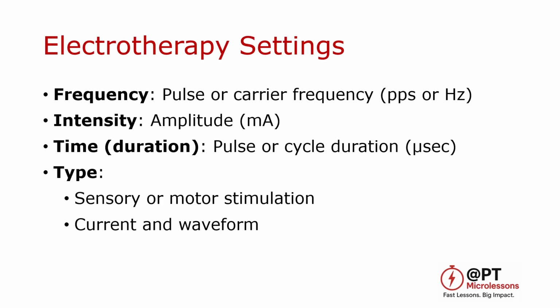Next, we'll look at the NMES settings. Now remember, we can organize these settings using the FIT framework. This framework helps us make sense of the parameters, even though in the clinic we may adjust them in a different order based on the treatment goal. So let's review each part.